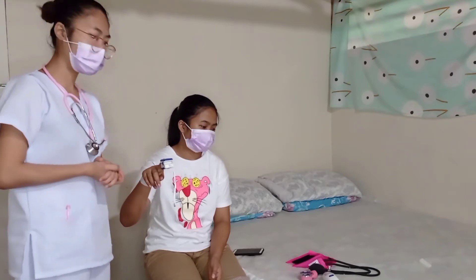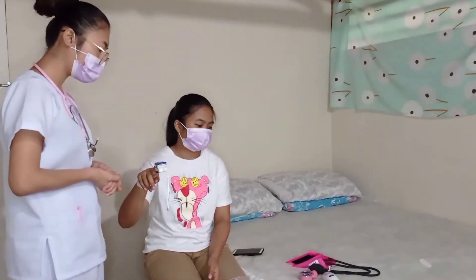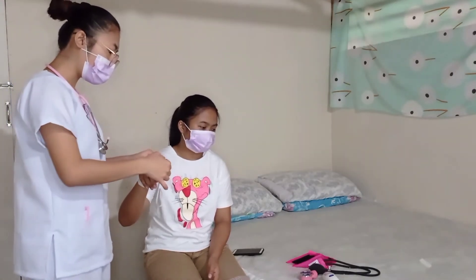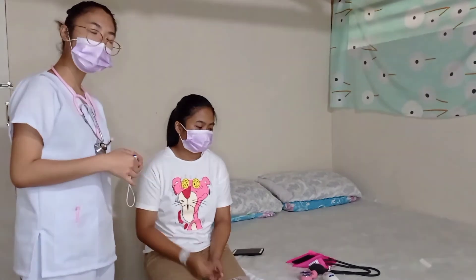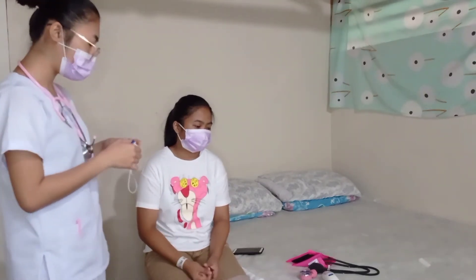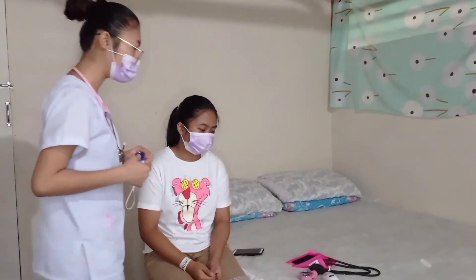The normal oxygen saturation is 95 to 100 percent. Her oxygen saturation is 96 percent, which is normal. So now I'm going to take my patient's body temperature.